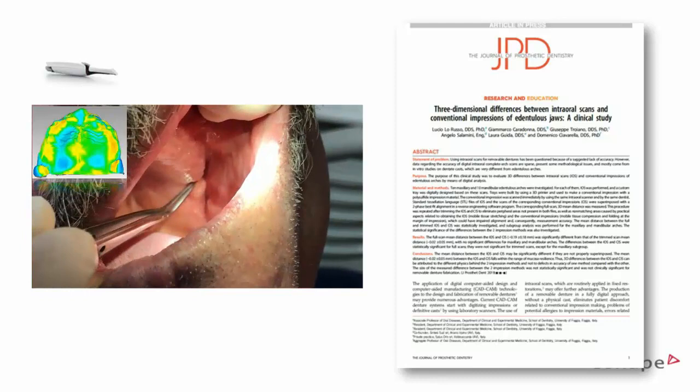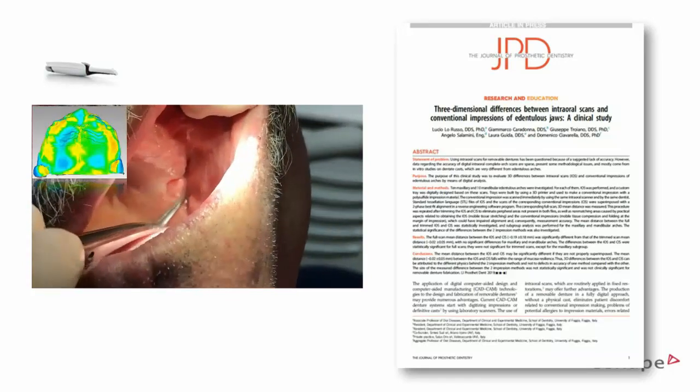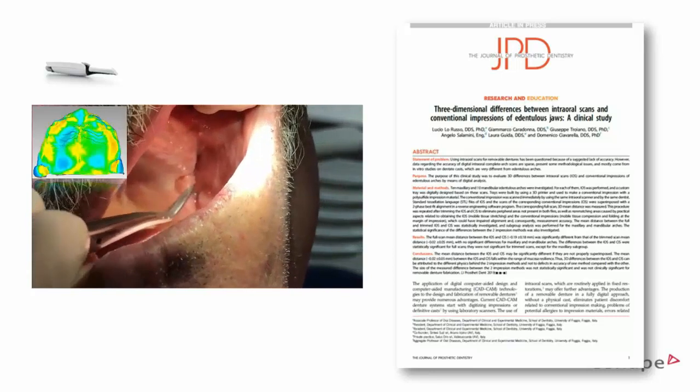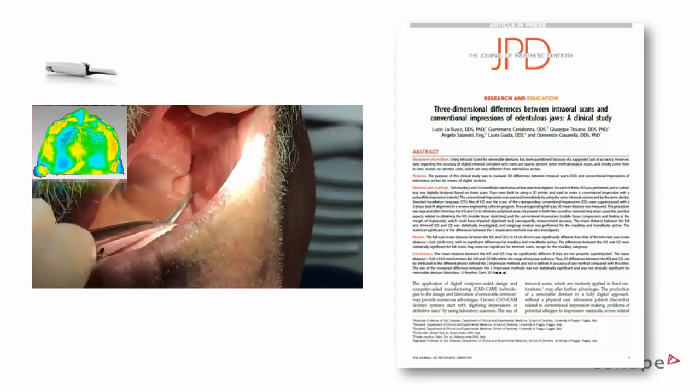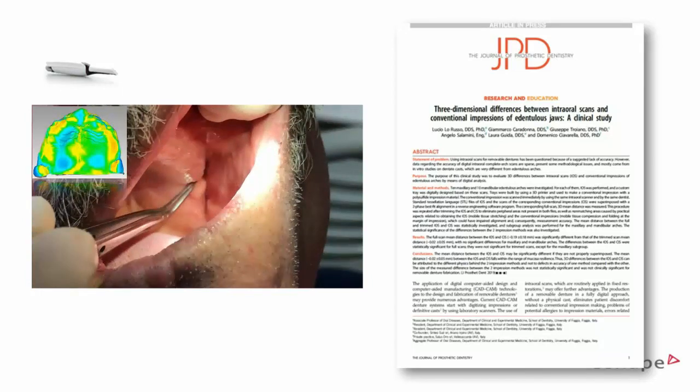But of course, you always need to have an appliance in the mouth to give you the bite. We will also see that some people are scanning 3D bite plates, or other people are scanning the AMD from Evident or similar things. Or you can also scan the classical wax bite, but it's a little bit harder to do that without at least marking it up.